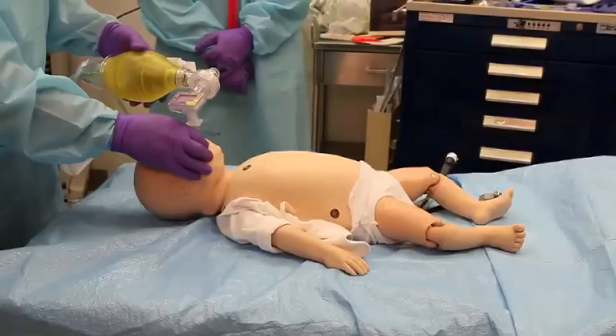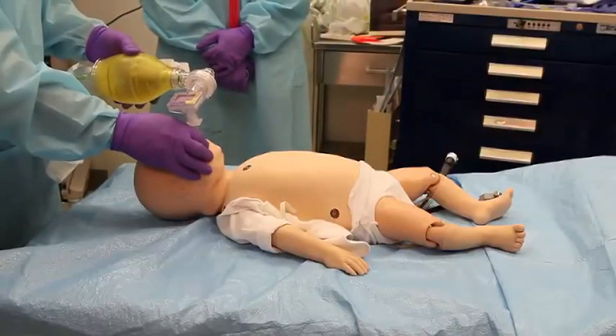Secure the tube. If the patient is moved, you'll need to reassess tube placement.